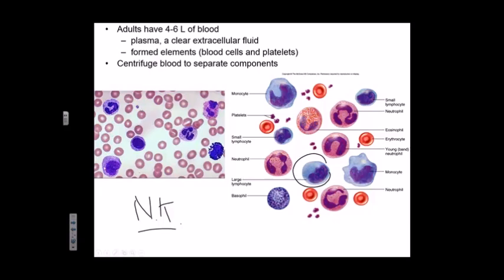And then we have a monocyte. Monocytes are bigger than the rest of the cells. Sometimes their nucleus has lobules, or has this type of morphology or this type of morphology. And it has a lot of cytoplasm compared to lymphocytes. So those are the cell types.